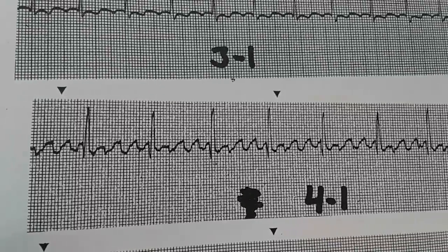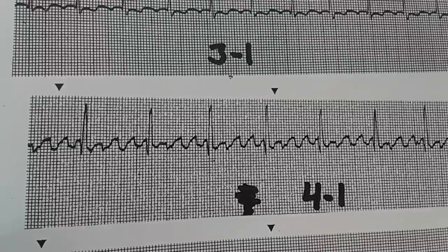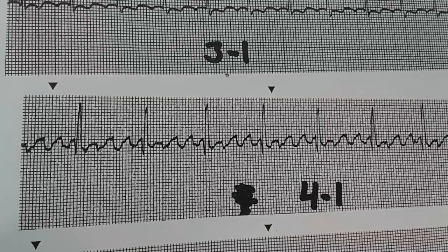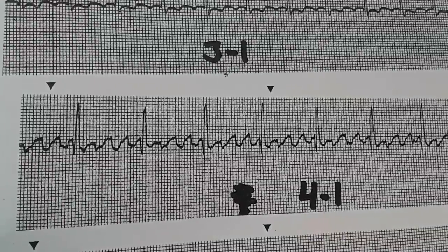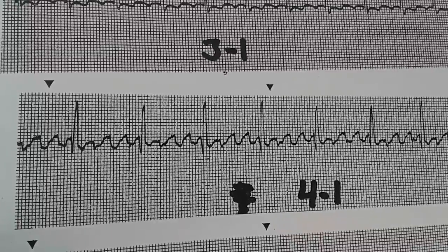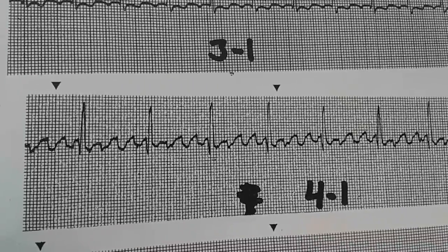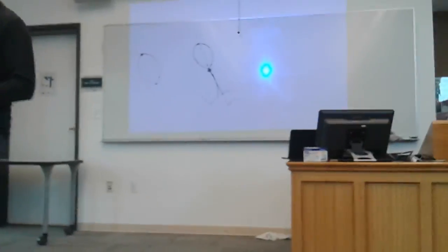The morphology is the same. If we were to take out the ventricles completely, if we were to isolate the ventricles out, we would see nothing but the same waveform going back and forth the whole time. We then add the ventricles back in, we add the QRS complex back in and the T wave back in, and now we see some changes in the morphology where the QRS complex is, and where the T wave is, because of the QRS complex and because of the T wave. Does that make sense? Yes.